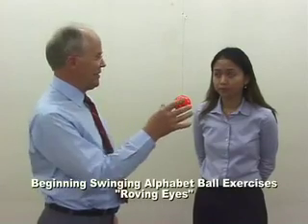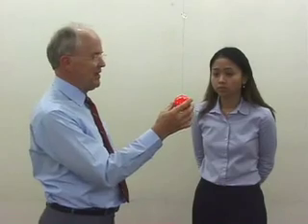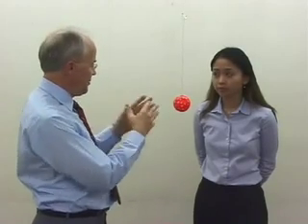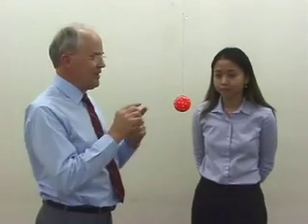All right, now we're going to demonstrate the Marsden ball technique. Nora, as you can see, there are numbers on this ball. Sometimes there's letters. The reason for that is that it gives you a small target to look at, and it tells you when you're focusing on it properly or not. So if the letter is blurred, it means you're not tracking properly.